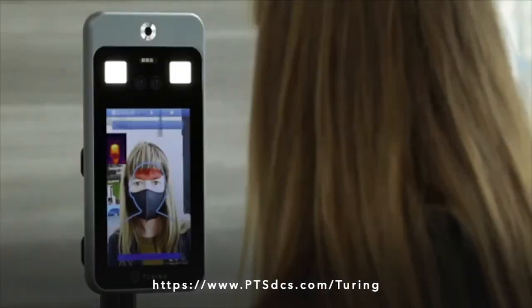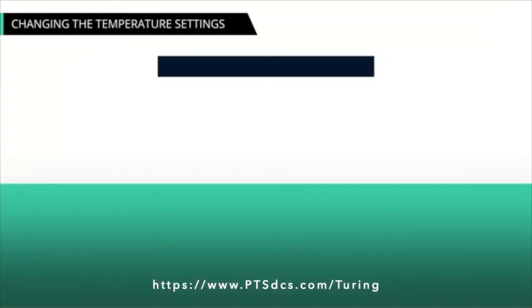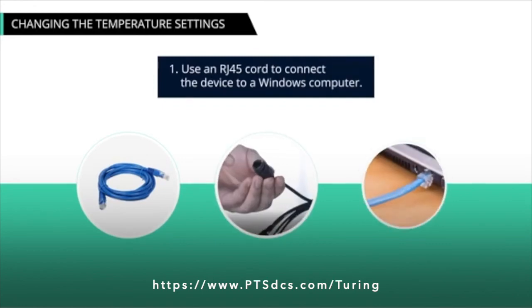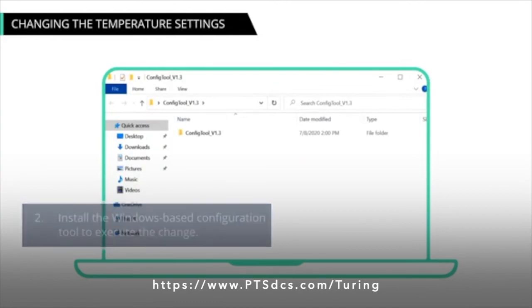The scanner generates an alert when the temperature reading is above the acceptable temperature recommended by your organization. Your temperature is out of the recommended range. If you need to change the temperature settings, you can use an RJ45 cord to connect the device to a Windows computer and install the Windows-based configuration tool to execute the change.